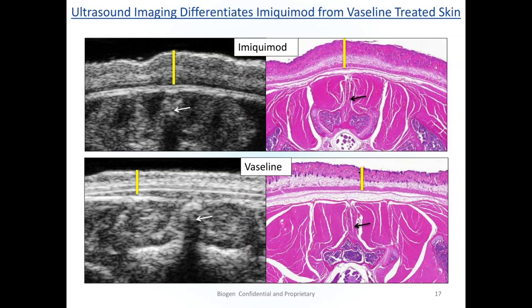Yeah, and I think you're right. I think generally when people say clinical ultrasound, they're talking about maybe up to 10 or 15 megahertz, as opposed to what you're using here, which is 50 megahertz. Yeah. So I think it's actually a completely different realm. For example, we have a clinical ultrasound device which goes up to 50 megahertz center frequency, and that's why I wanted to ask you about this. If you can measure differences in the layers of mouse skin, I would be surprised if it wouldn't be useful in the human situation.